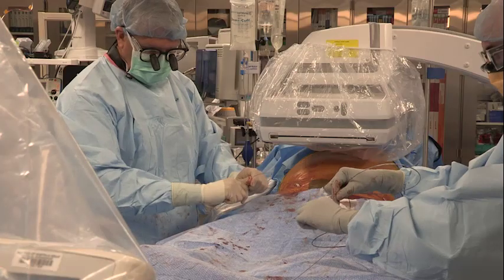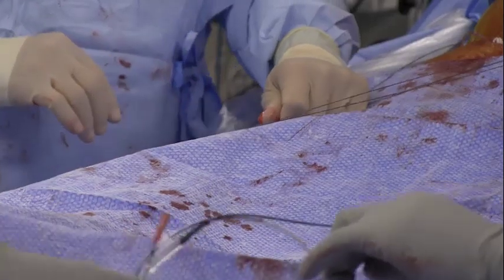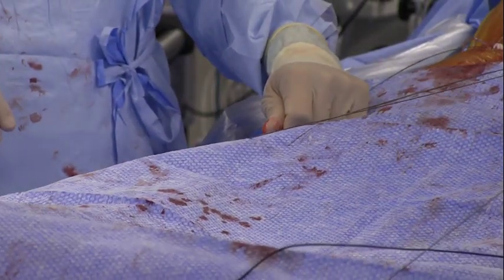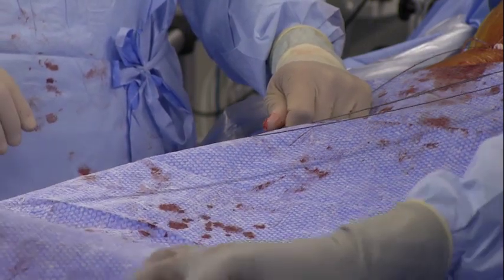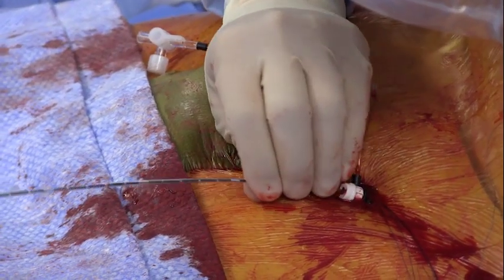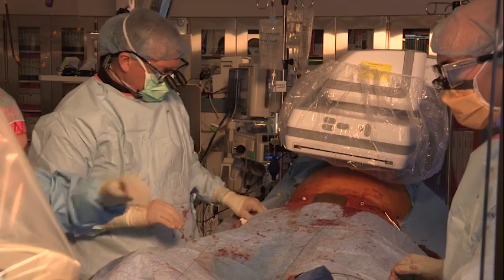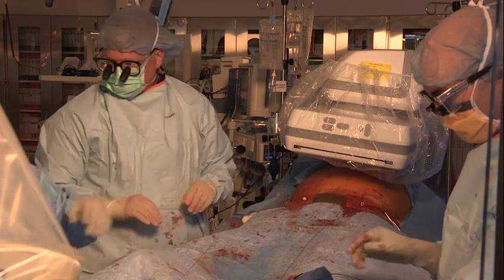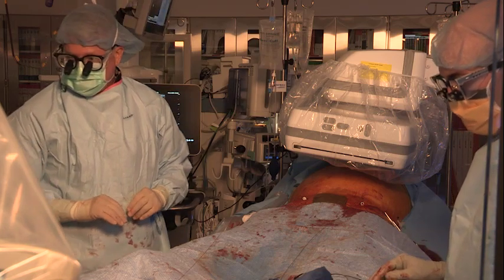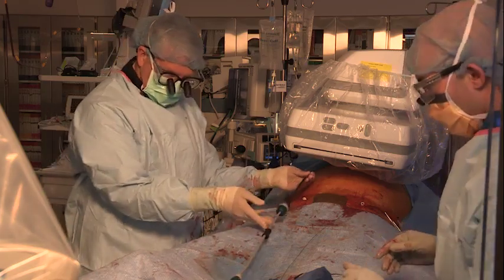To proceed with aneurysm treatment, exchange the 6 French sheath for a larger sheath appropriately sized for the endograft, or for the main body device if going bare. If using a floppy guide wire at this time, exchange it for a Lunderquist extra stiff wire. Check the ACT at this time. If the ACT is less than 300 seconds, give more heparin until the ACT is 300 seconds or greater.